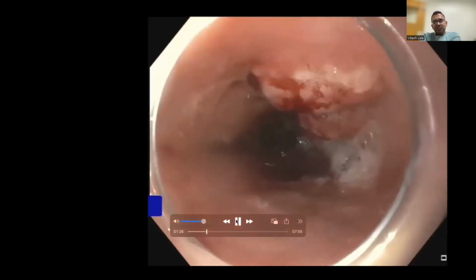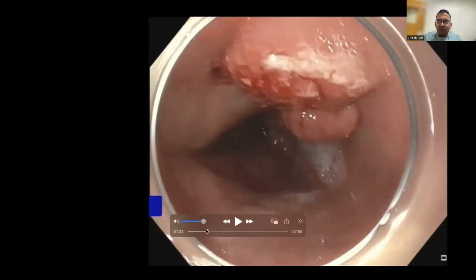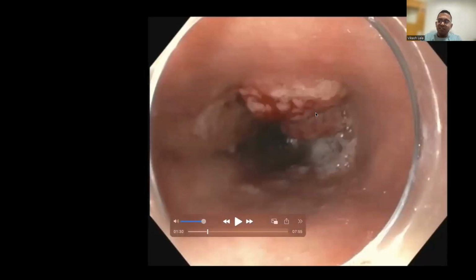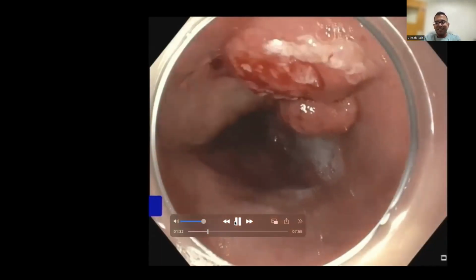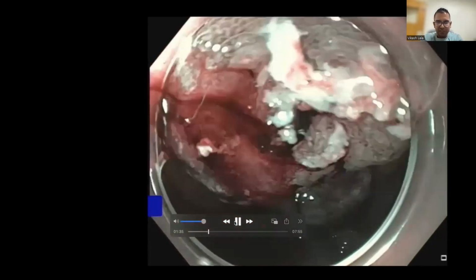And you can see that this lesion probably was spontaneously bleeding. So just in terms of your first impression or your blink impression, there's certainly concerning features. Spontaneous bleeding, extra redness, and definitely bulkiness with these two nodules here. So your first impression is already telling you there is a problem here. And I'm quite worried that the problem is that of malignancy.